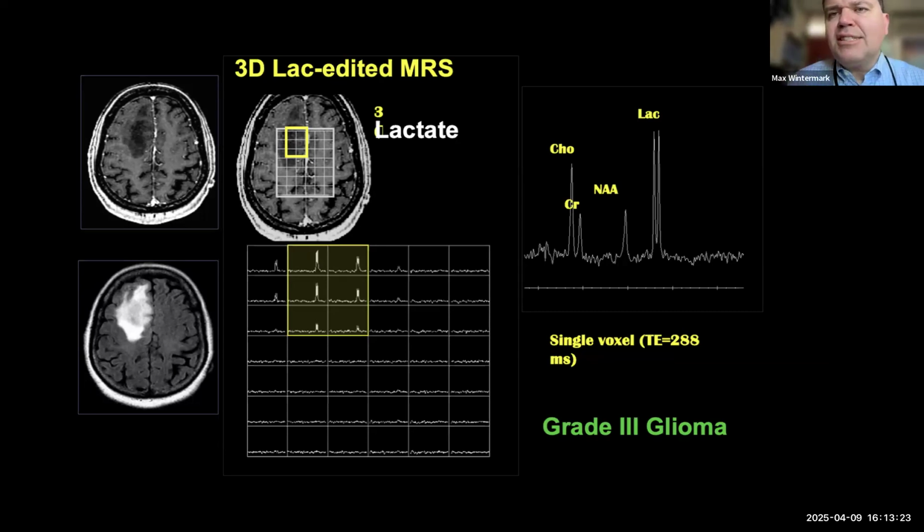So what I'm trying to say is you don't just look at the perfusion, you incorporate all the information. The perfusion adds confidence when you see that either the cerebral blood volume is very decreased or very increased. The reality is that doesn't always happen, and there are some cases where you're right in the middle and you don't know if it's really decreased or really increased.